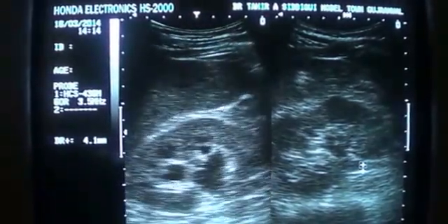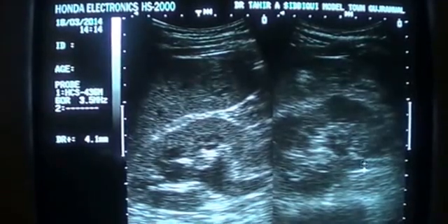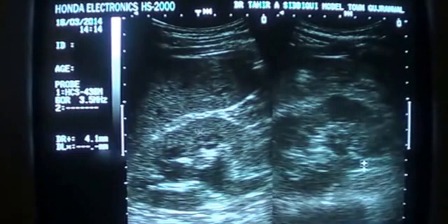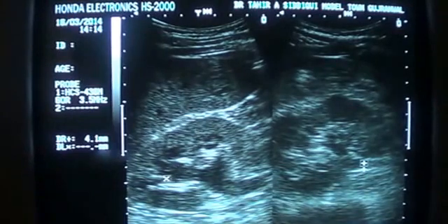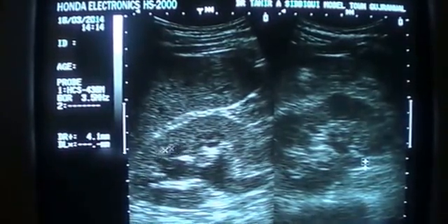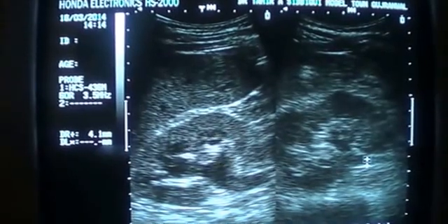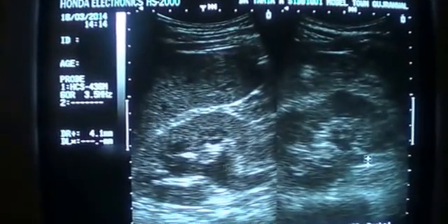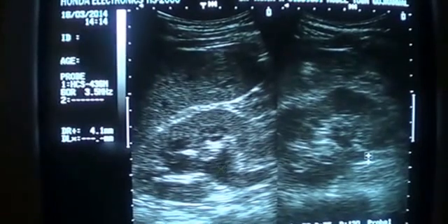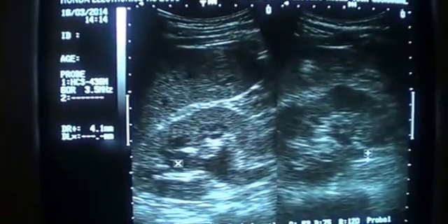Now you can see that this kidney is showing us these are the pyramids — these small cystic areas. Don't confuse them with the dilation of the calices or hydronephrosis.